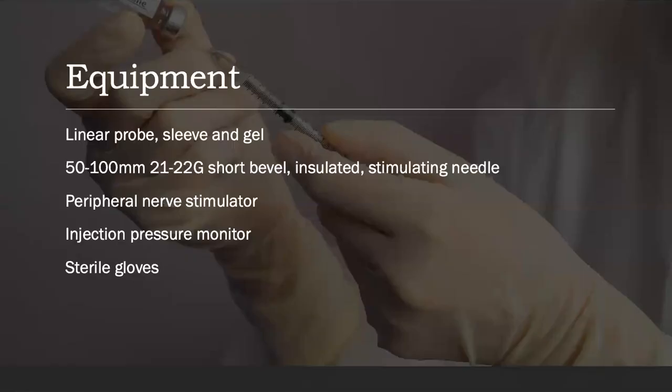In terms of equipment, we need to prepare our linear probe. We have to have a sleeve — a sterile one preferably — to cover the probe and protect it, ultrasound gel, a 50 to 100 millimeter short bevel insulated stimulator needle, as well as a peripheral nerve stimulator, an injection pressure monitor, and sterile gloves.